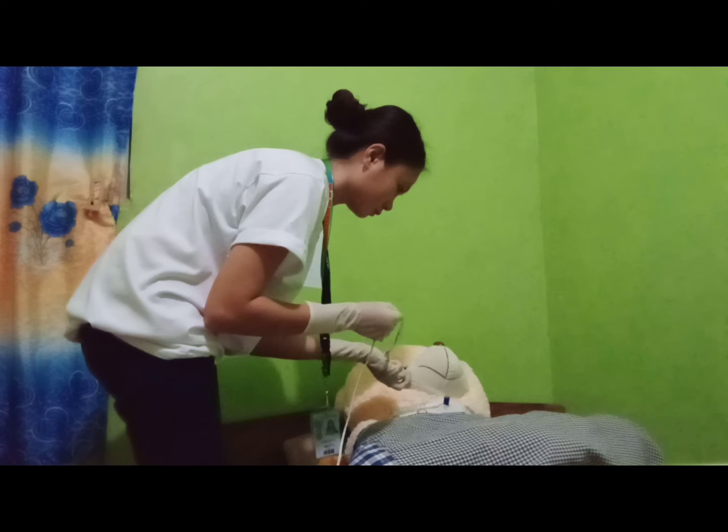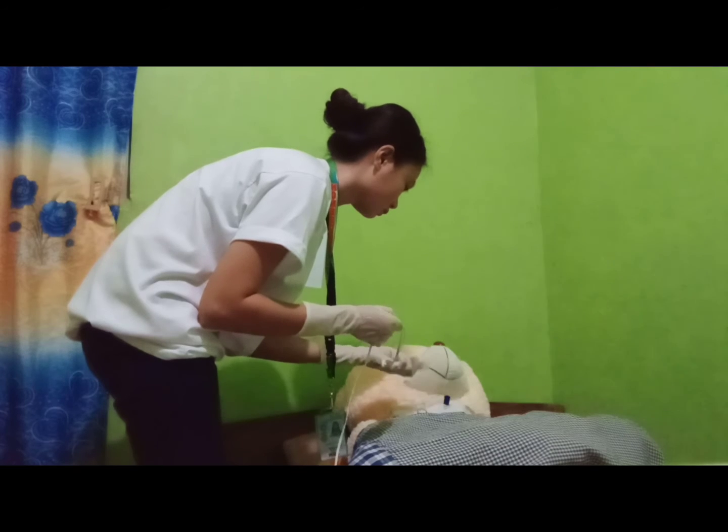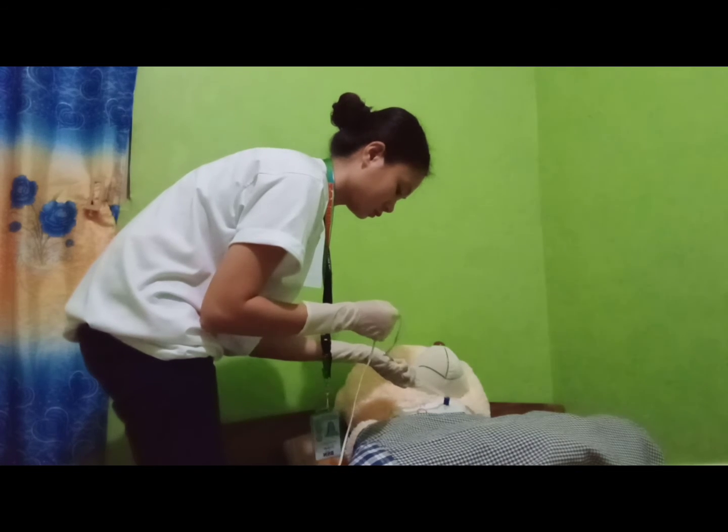Encourage deep breathing. Replace oxygen if applicable. Repeat steps 16 and 17 as necessary to clear oropharynx. Rinse catheter and tubing by suctioning saline through.